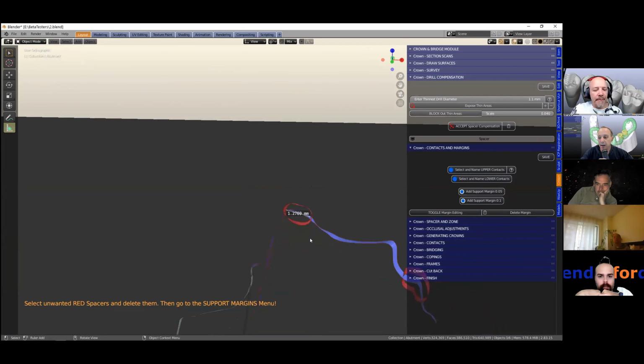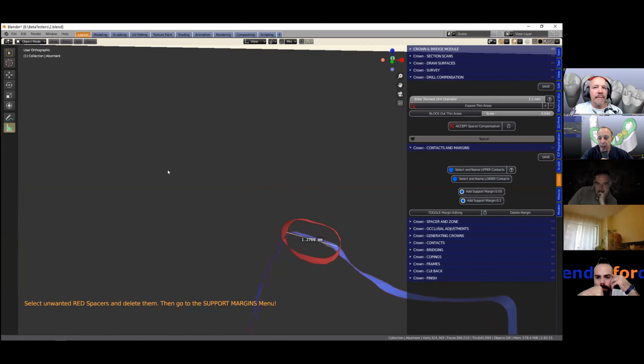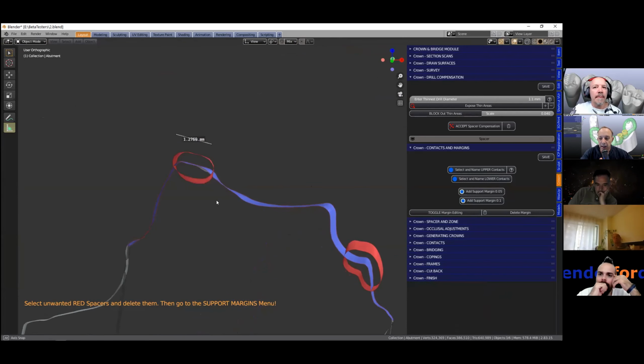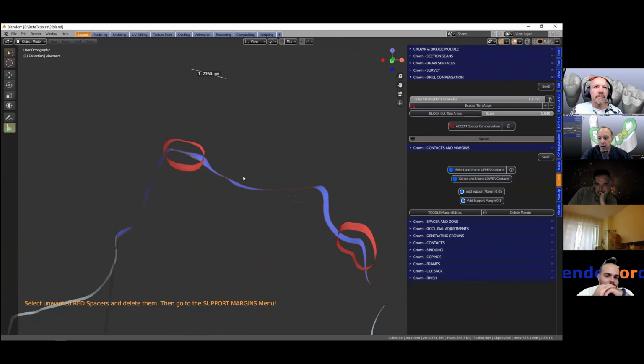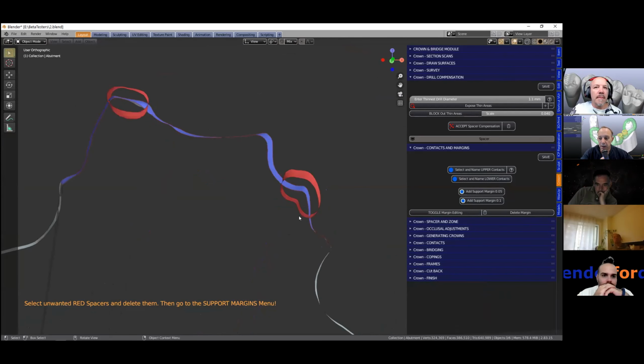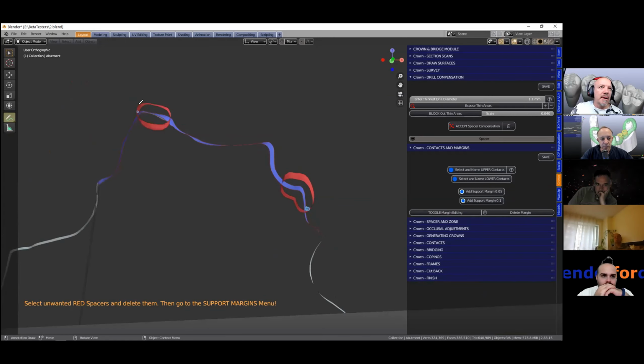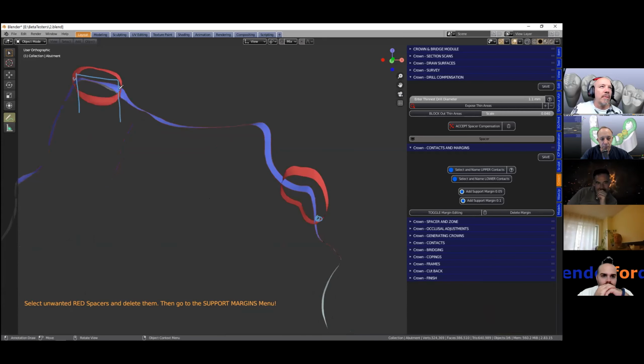We had a question about the 4-axis milling machine. So 4-axis, of course, it can't get into the curvature of this cavity. It would only allow Z-axis entry into the cavity, wouldn't it? Yeah, so I would assume that undercut areas like this, it wouldn't reach. It wouldn't reach, but surely the burr would still go up here. Look, I'm not 100% sure there, but of course it wouldn't be able to go here.